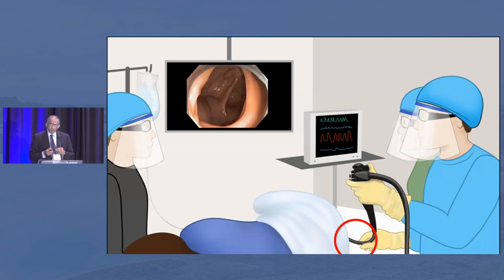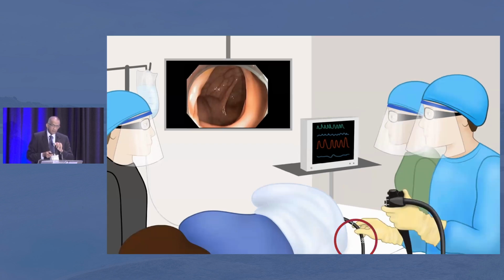I don't know how many fellows are here. If there are fellows, I want to share one thing. As you're learning colonoscopies, it is not about reaching the cecum fast, but reaching the cecum with the shortest scope, 60 to 70 centimeters. If you practice that, you will be able to do EMR. If you go with a long looping scope, you will not have tip control to be able to resect safely. So the most important thing in EMR, first step, is to reach the cecum with a short straight scope so that you can dance around the lesion to cut the polyp.